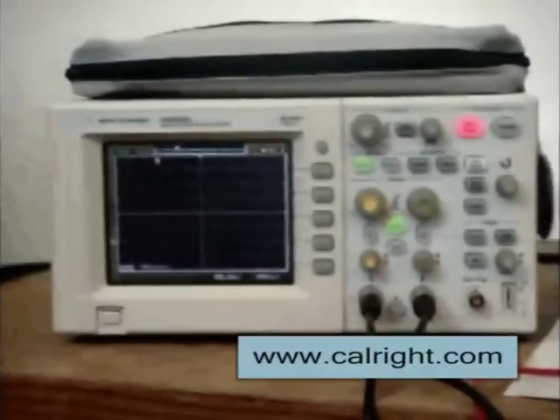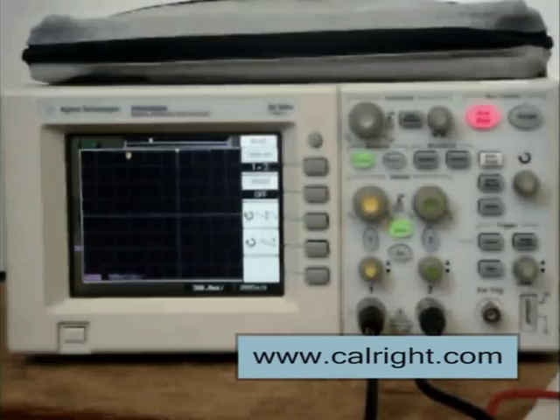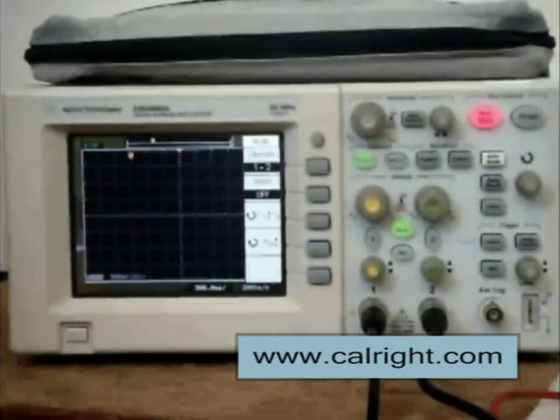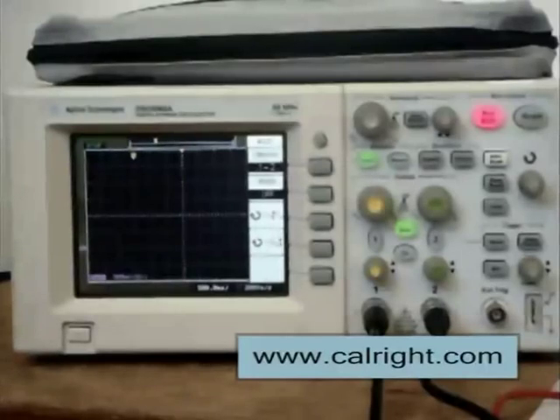On the oscilloscope, locate the math function and set it to channel 1 minus channel 2. For triggering, set the channel 1 trigger at 100 millivolts. Each scope will be different, but for this step, turn the display of channels 1 and 2 off. Set the scope to display only the math function. Then, set the time delay for 500 milliseconds.